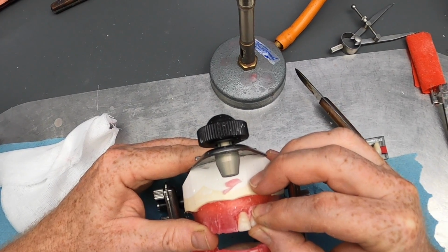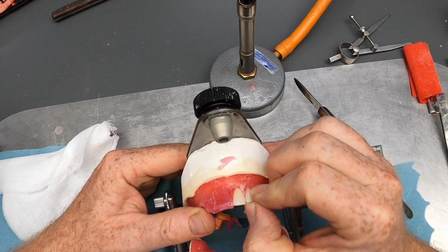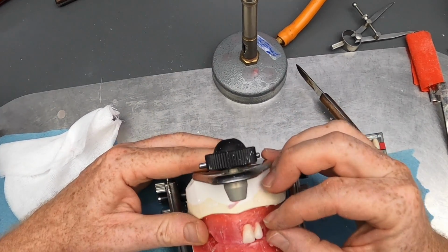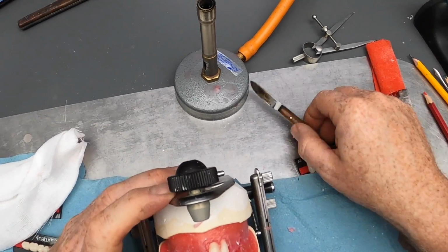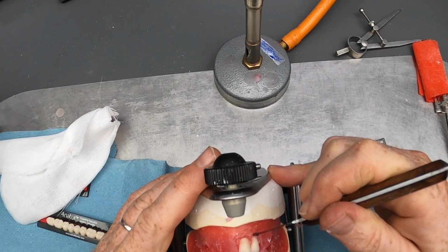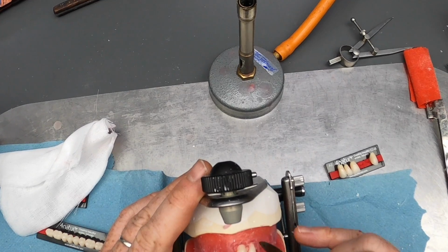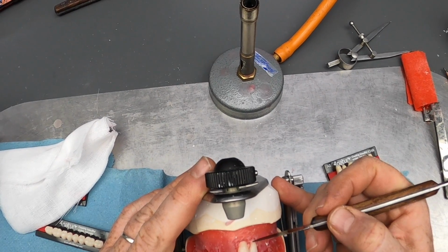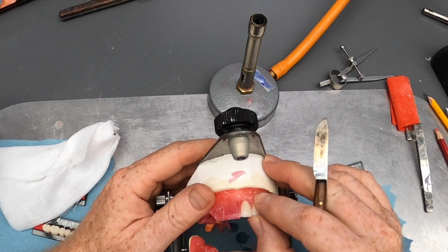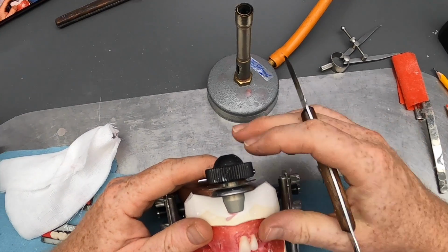position that such that it butts up to the central incisor, following the contour of the block around, and then we want the incisal edge just slightly higher than the occlusal plane. Again, you'd follow any instructions, but here just going for about 1 millimetre above the occlusal plane, with the long axis of the tooth rotated round, again cervical area of the tooth tipping towards the alveolar, keeping the incisal edge flush with the rim.